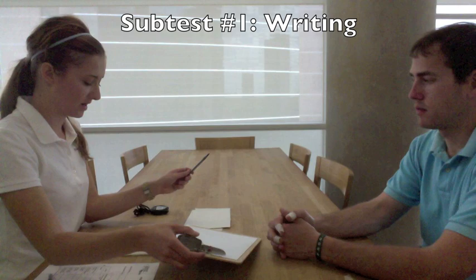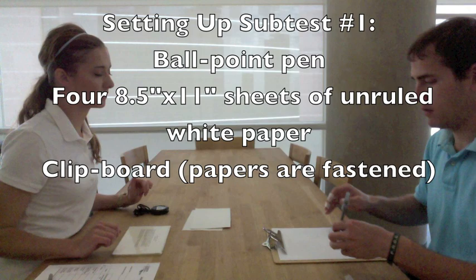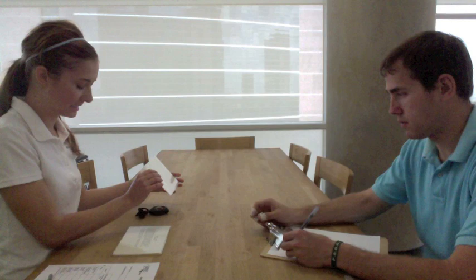The therapist asks if the patient has any questions, then checks: 'Do you require glasses for reading or contacts?' The patient confirms wearing contacts. She then instructs: 'Take this pen in your left hand and arrange everything so it's comfortable for you to write with your left hand. On the other side of this card is a sentence, and when I turn the card over and say go, write the sentence as quickly and as clearly as you can using your left hand. Write, do not print.'